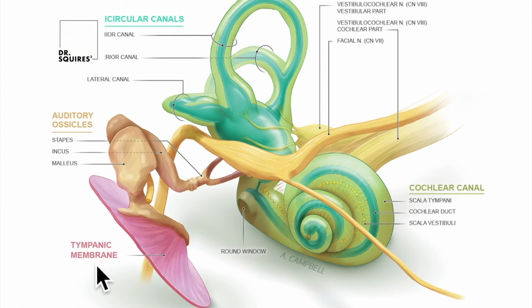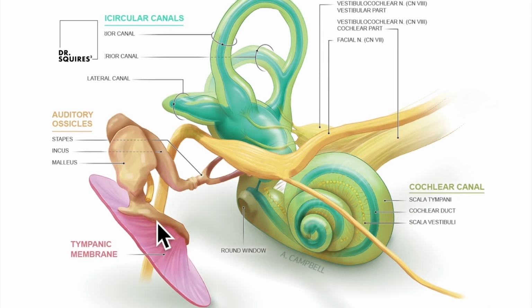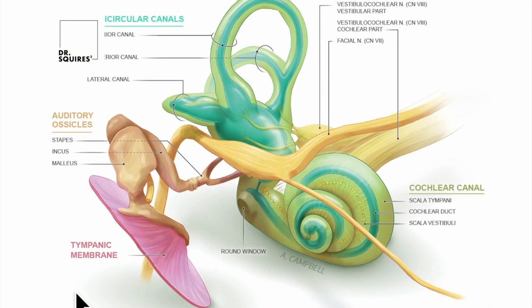Now this is a very, very slight response, which is why it's really important that the environment is really quiet. As an example, from the point here to the eardrum, when crossing these bones, that response is losing 30 decibels of energy. So the quieter the environment, the quieter the patient, the better responses that we're going to get. But that is the anatomy of the distortion product otoacoustic emission.